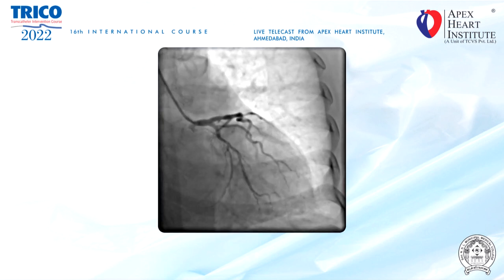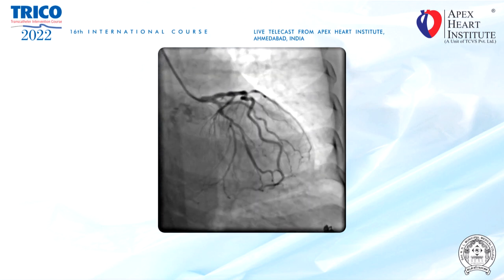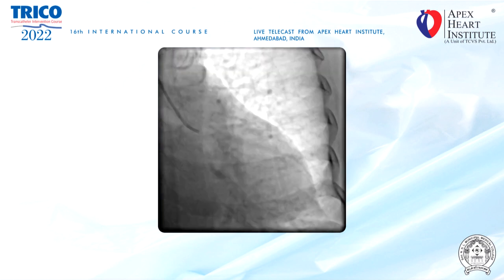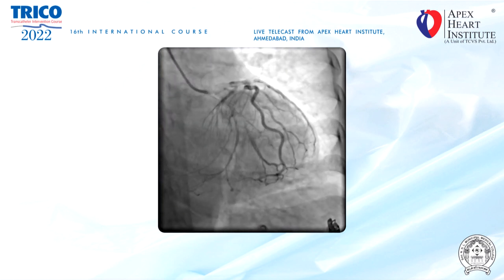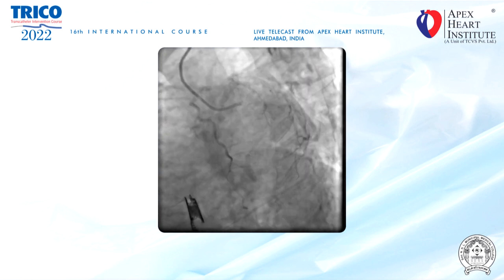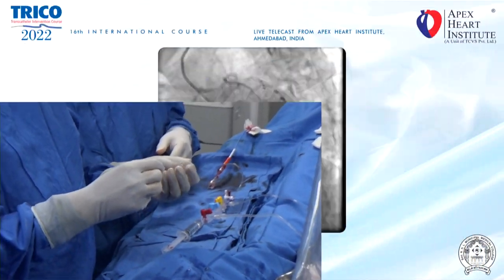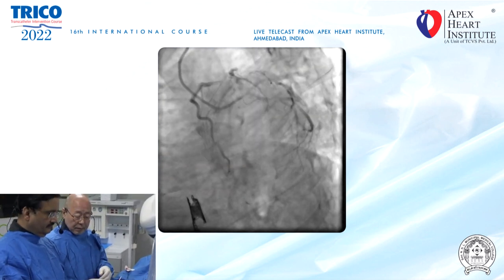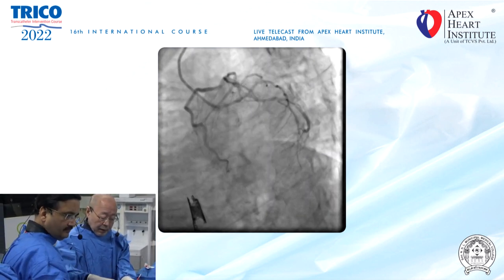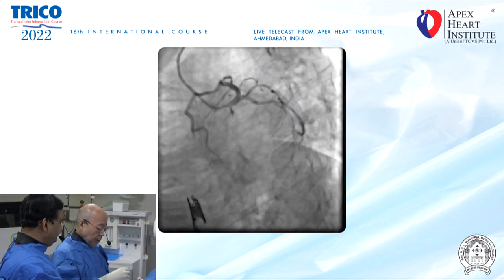Good morning, professors. It's Sanjog Kalra. Thanks for the privilege of being here. I'm looking at your diagnostic films as well as your initial film here with an EBU guide well engaged. There isn't much in the way of pressure dampening, and I don't see a ton of stenosis at the ostium of the left main. Do you think there's a role to use intravascular imaging up front to try to define whether or not that angiographic stenosis that we see in some of the views is actually tight enough to justify PCI? We have pretty good cutoffs on IVUS, for example, for the ostial left main. Dr. Saito, you're on.